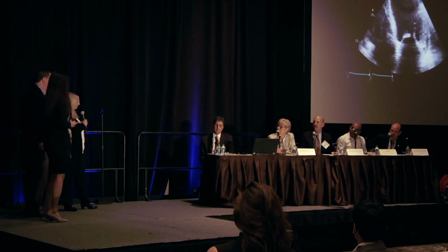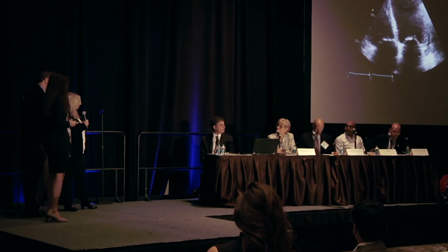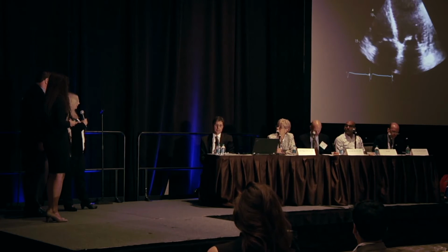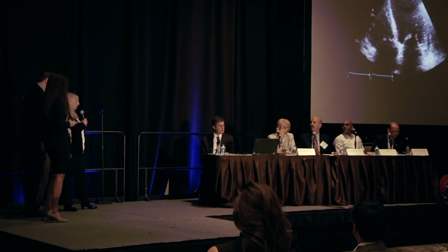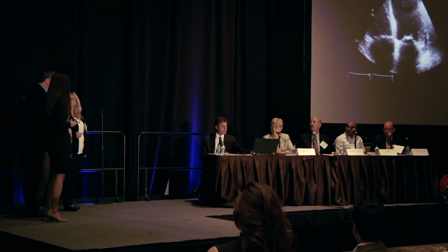Has it been validated with MRI? Not yet. And can you do strain as well as EF? Yes, in our segmental wall motion evaluation, we provide segmental scores similar to eyeballing, as well as segmental strain, and of course GLS and segmental score index. One more thing concerning the MRI.